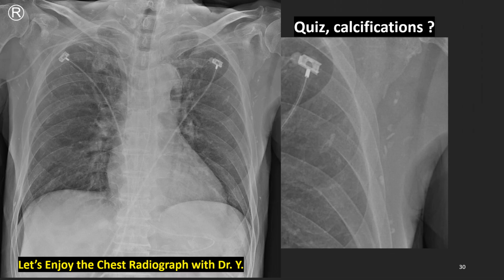This is the quiz for the next session. What are these? Where are they? What caused this kind of calcifications?